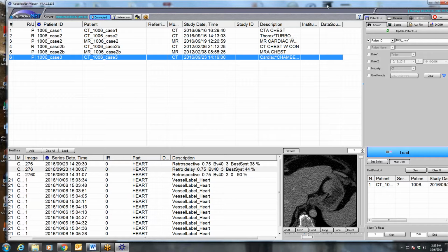And nothing on the kidneys or otherwise to suggest something weird? Erdheim-Chester can sometimes do that. Evidently, Rosai-Dorfman can have a vasculitis component. I haven't pulled any literature on that yet, but it just came up late morning as a possibility. Given the substantial lymphadenopathy and the very clean look to it, it looks like sarcoid. There are probably a lot of case reports of entities like that in the literature, which nowadays would probably be diagnosed as IgG4 sclerosing disease rather than any one of those other things.